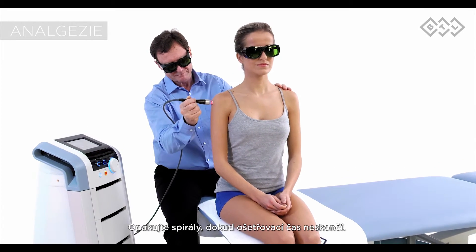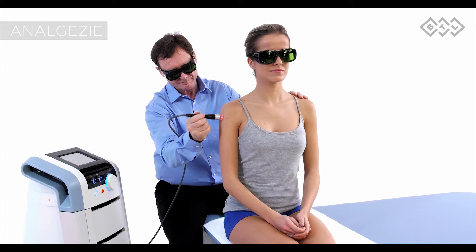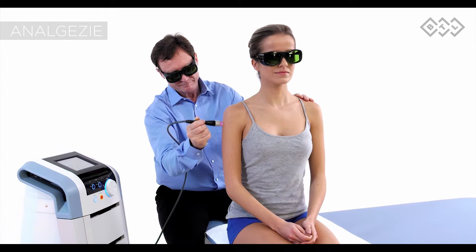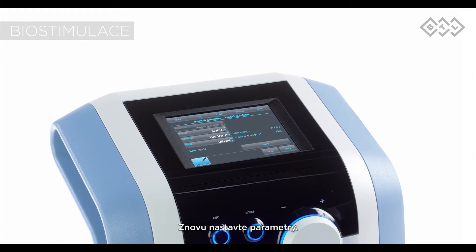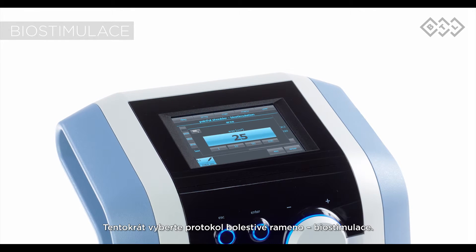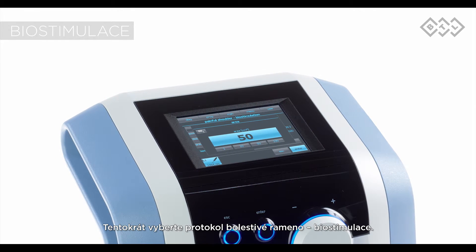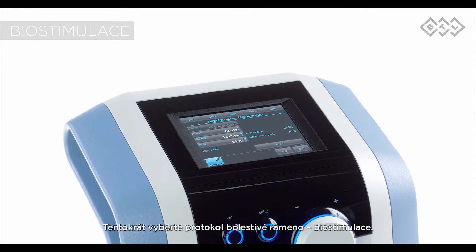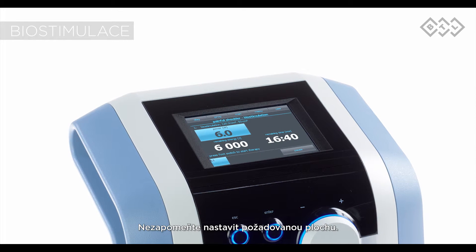Repeat spirals until the therapy time is up. Then readjust the parameters and select the protocol for painful shoulder biostimulation. Don't forget to set the desired area.